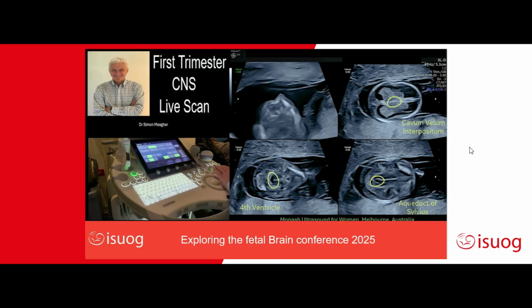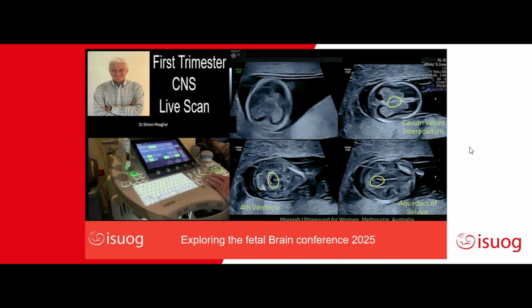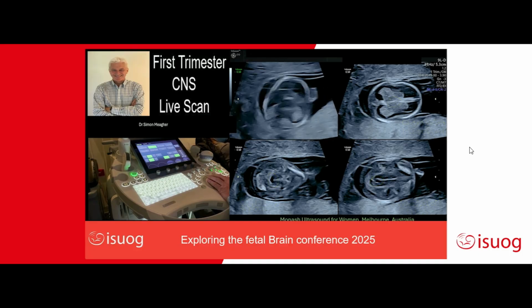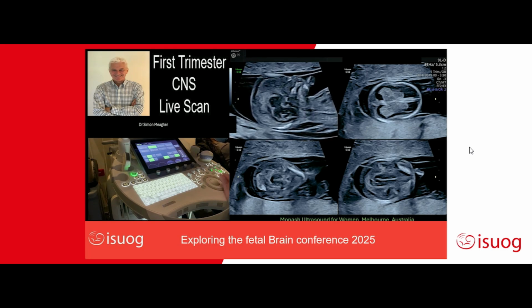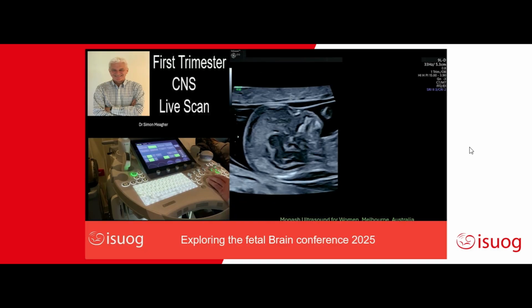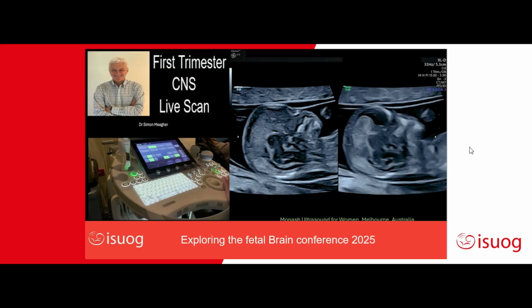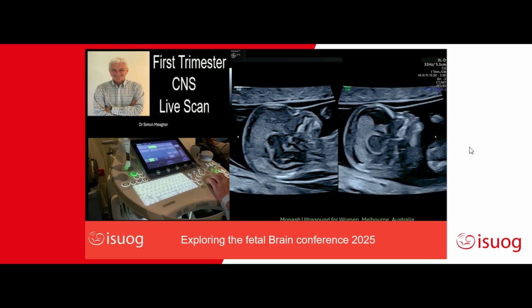We show getting the position of the head so that the occiput is up at 12 and it's very active. So once it's in that position, once I've got perfect symmetry up at 12 o'clock, I flip 90 degrees, and that's where I expect to see my landmarks. And I'll go into a split image here, coming down here, and I'll show you that that's slightly different to obtaining your profile view. If I just rewind that, I think at the very beginning it showed.